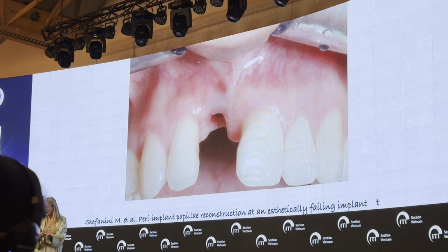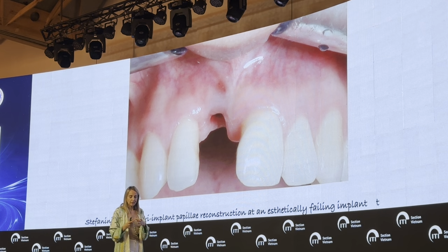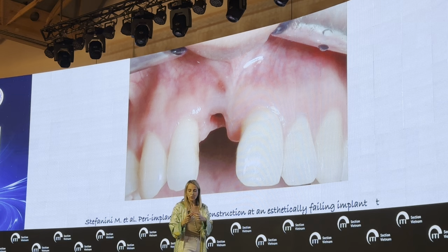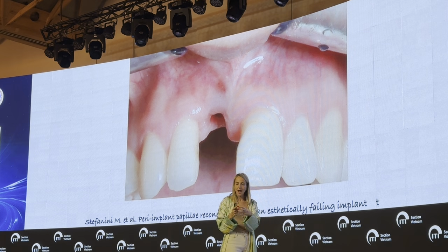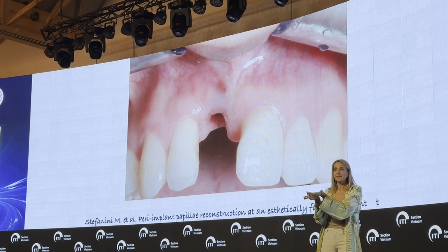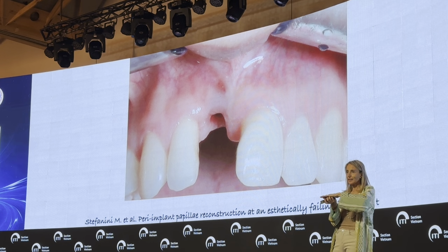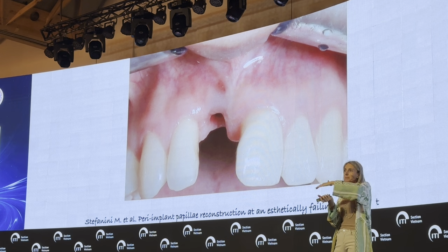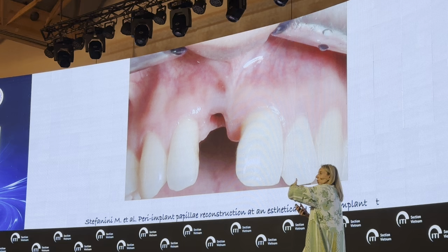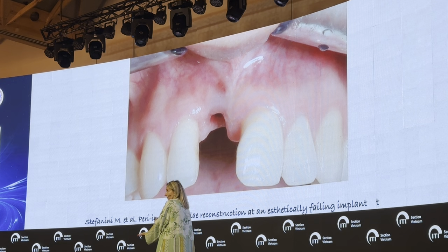connective tissue platform technique, which is a technique that creates an area in the occlusal aspect of the edentulous area that is deepithelialized, and above which you can apply a layer, or sometimes even more, of connective tissue graft, and then you completely cover with the coronally advanced flap.